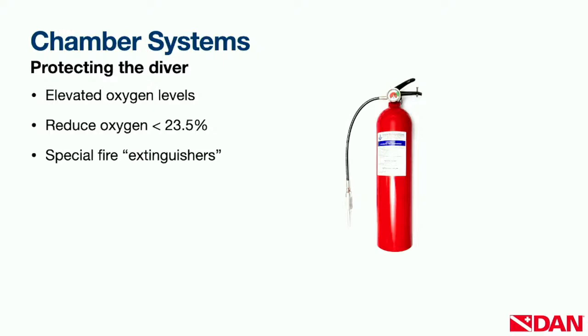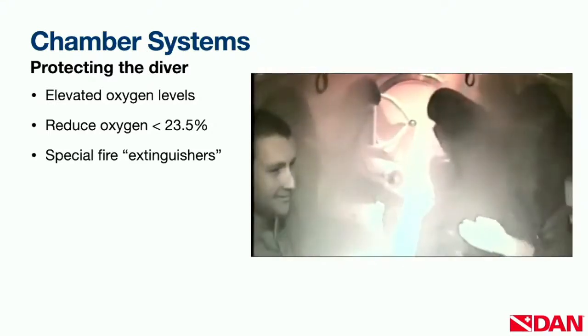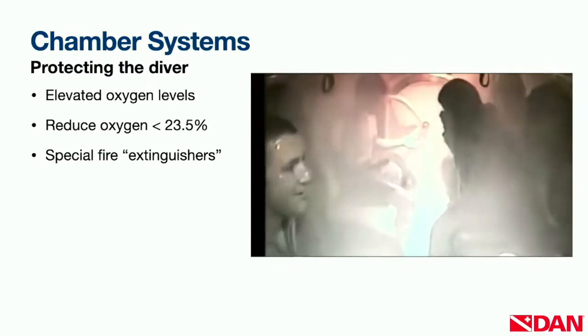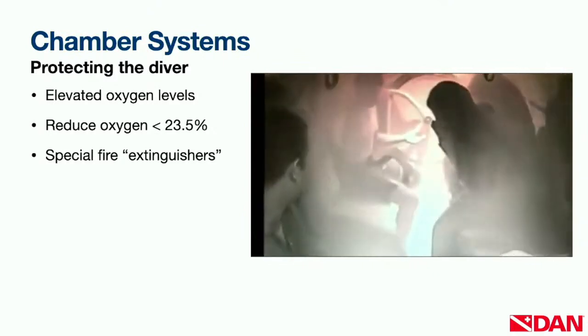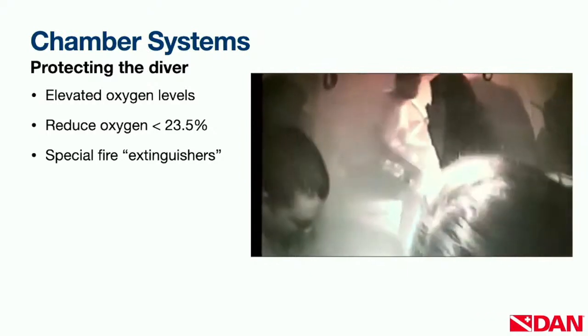Typically, we use a water extinguisher, or we'd have what they call a foam-filled, a liquid foam-filled product, which is very effective at blanketing the fire. But what we like to see in the most acceptable, the safest of all the variations, is what you call a deluge system. And here you can see some divers having great fun. They've activated the fire deluge system just to give them that experience of being wetted. And they are highly effective at cooling things down and thereby containing the fire.